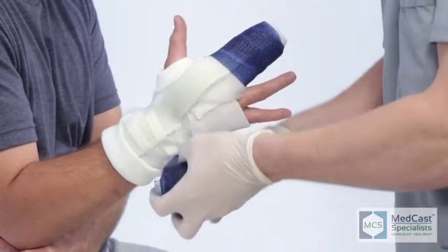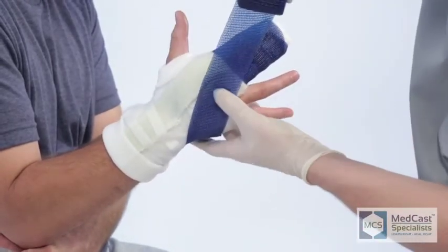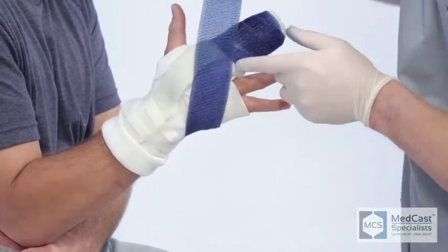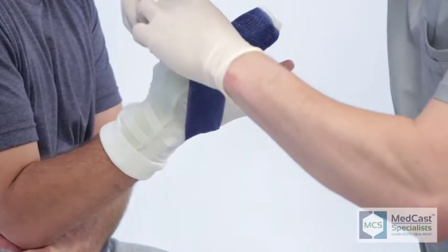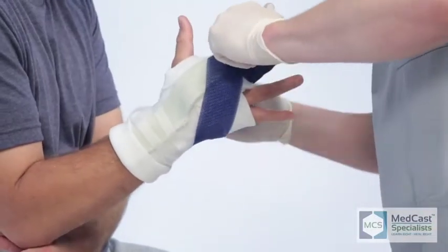Here we're weaving the cast through there. You don't have to cut it because you're incorporating the digits. The MCP joints is where you'll have the weakest points. So this is a way that you can get it stronger at those points.